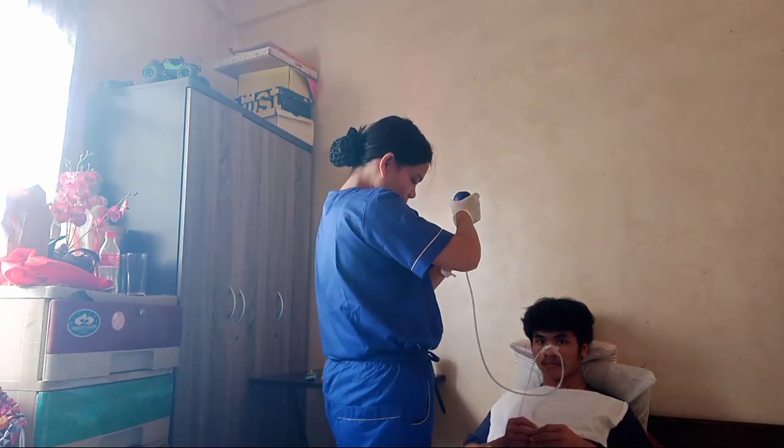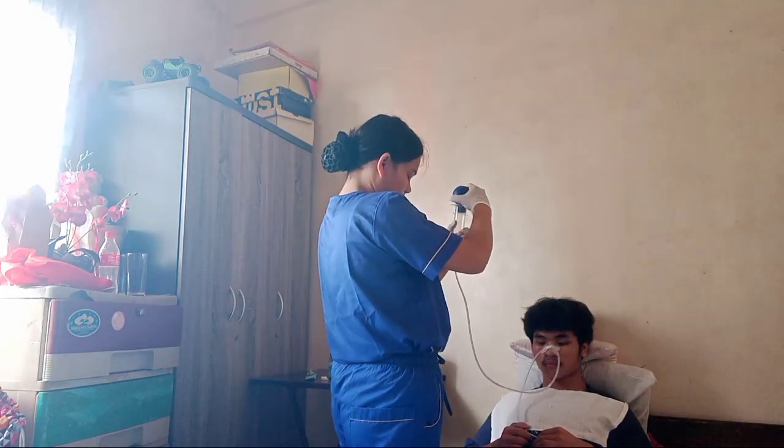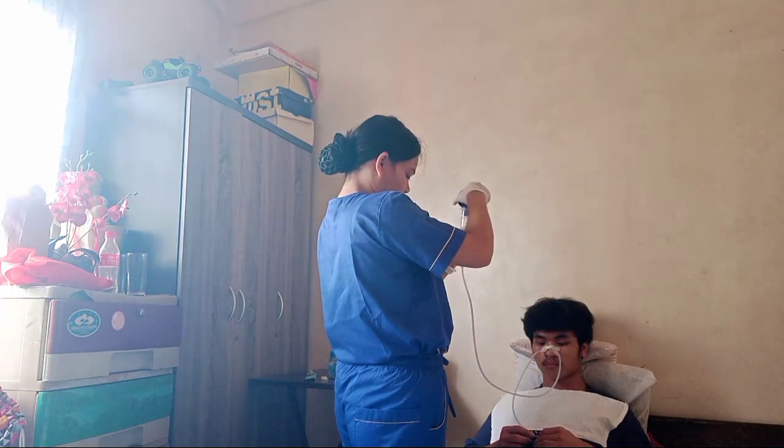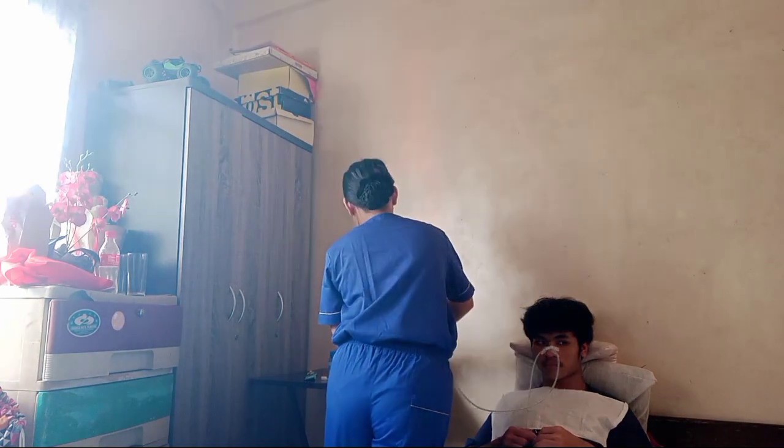Then after that, flush with water volume as ordered using the push-pause technique.